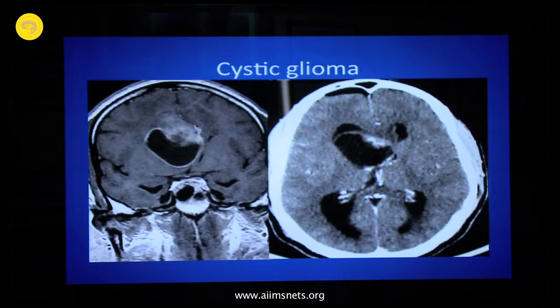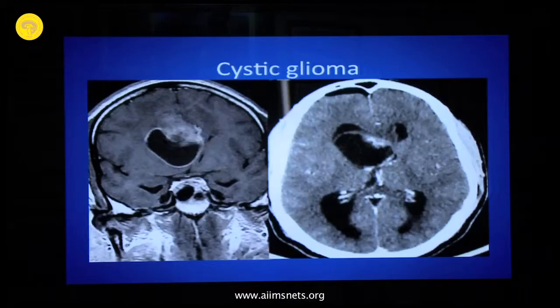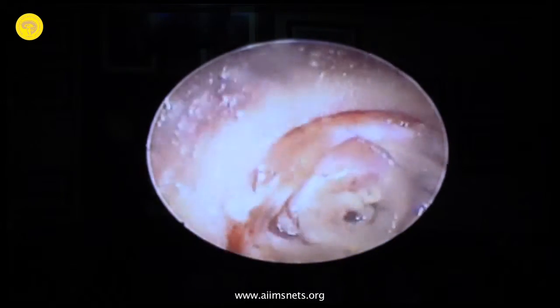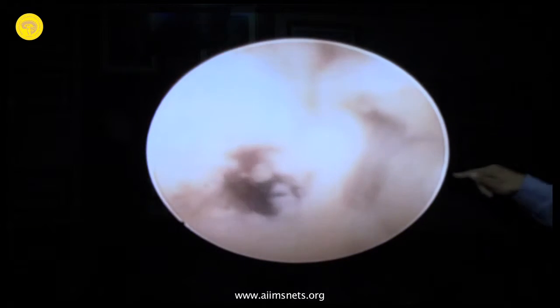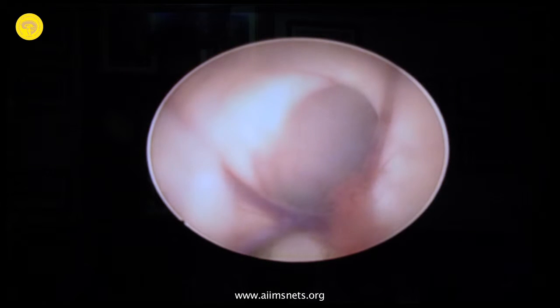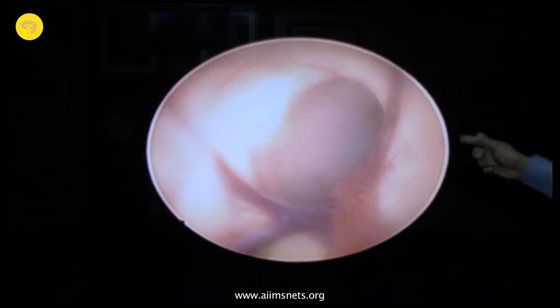The third is this very interesting case. You can take a biopsy, you can do a fenestration, a small burr hole, and by the third day the child can go back home, right? Now again the same thing, you go in again. Here another very interesting thing is this moment of truth. You usually don't see that, and so when you're going, you wonder, have I gone too deep? Where have I gone? Why am I not reaching the ventricle?